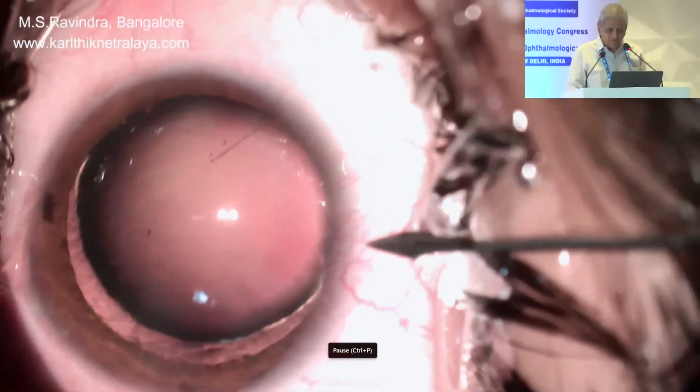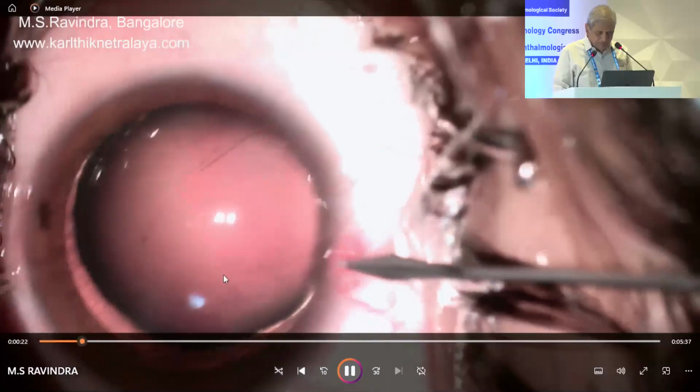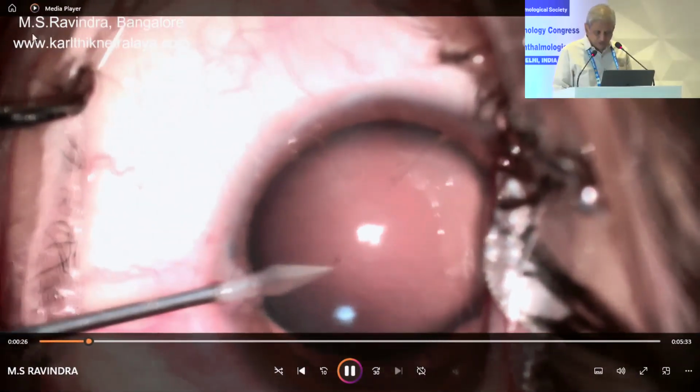This is the way I do a routine cataract surgery. I take a direct incision in the anterior sclera, go across the limbus and on a virgin conjunctiva. And this is a case of microspherophakia. The patient came with very high pressure. I had done an iridectomy there, which did not relieve the pressure, so I resorted to surgery.